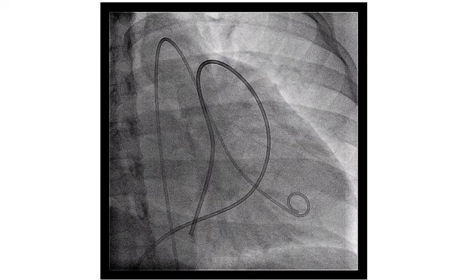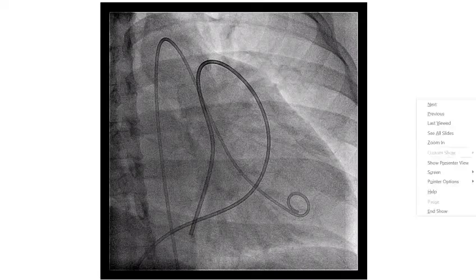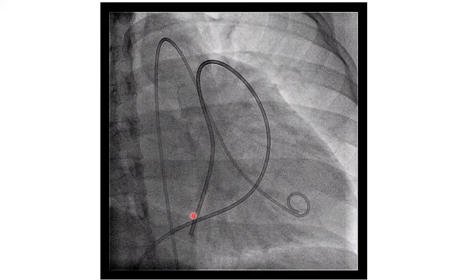Okay. Where is the catheter part? In the RV, I think. Is it in the RV or do you think that it is somewhere else? Where is this catheter? PA, sir. It is in the PA. From the PA, where has it gone to? Wedge. Yes, it has gone to the wedge position. Very good. What do you mean by wedge position?